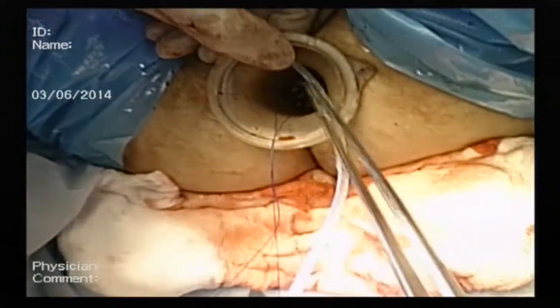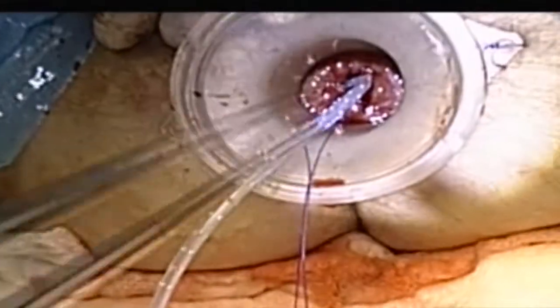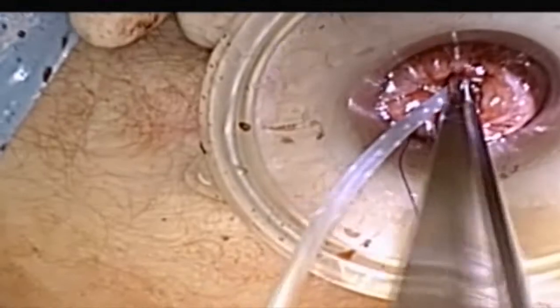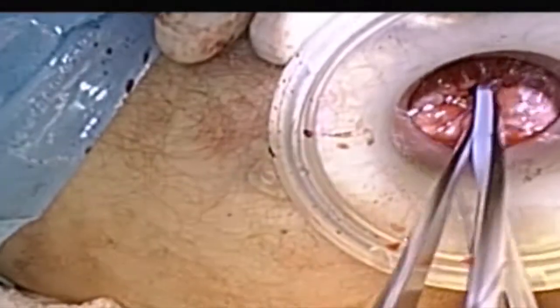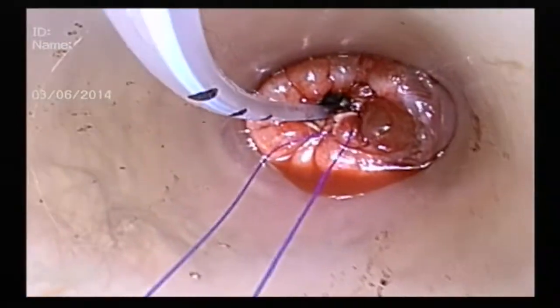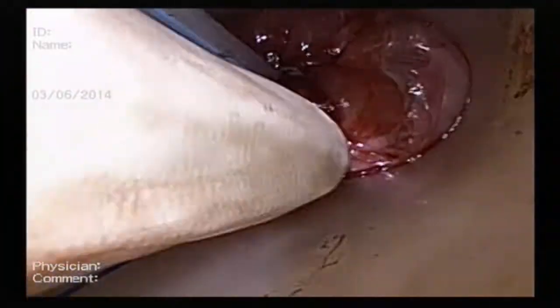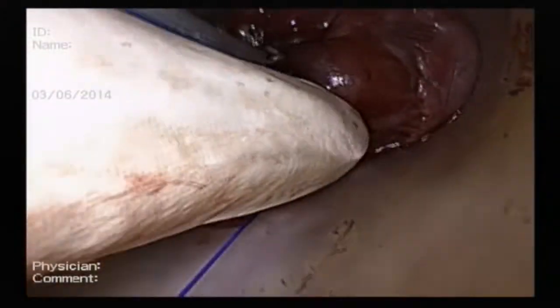The next step is to insert a standard 10 French ReadyVac drain through the centre of the purse-string, advancing the drain into the abdominal cavity. When the drain has been advanced far enough so that it is now visible within the abdominal cavity, the purse-string suture is knotted tight around the drain.